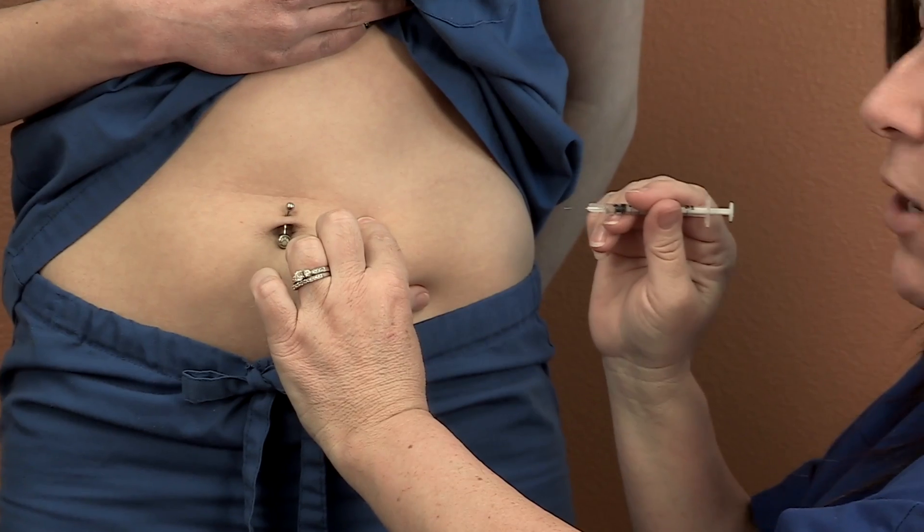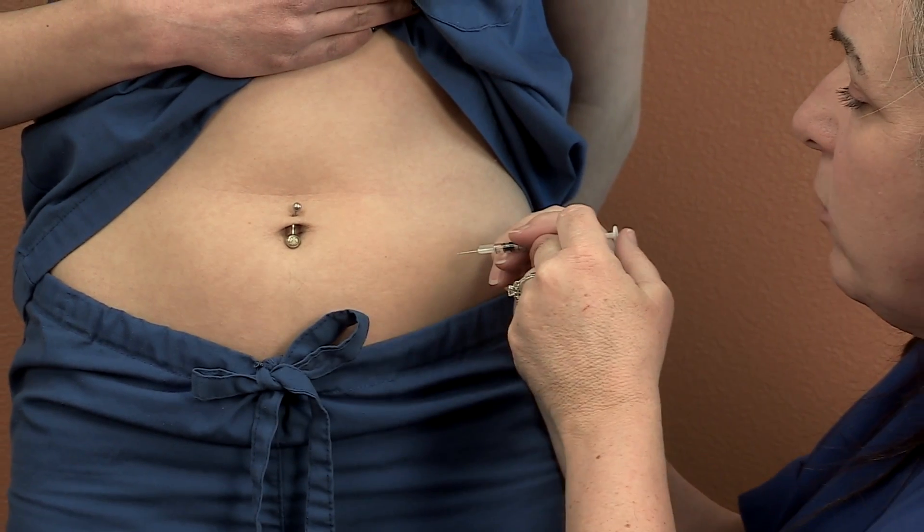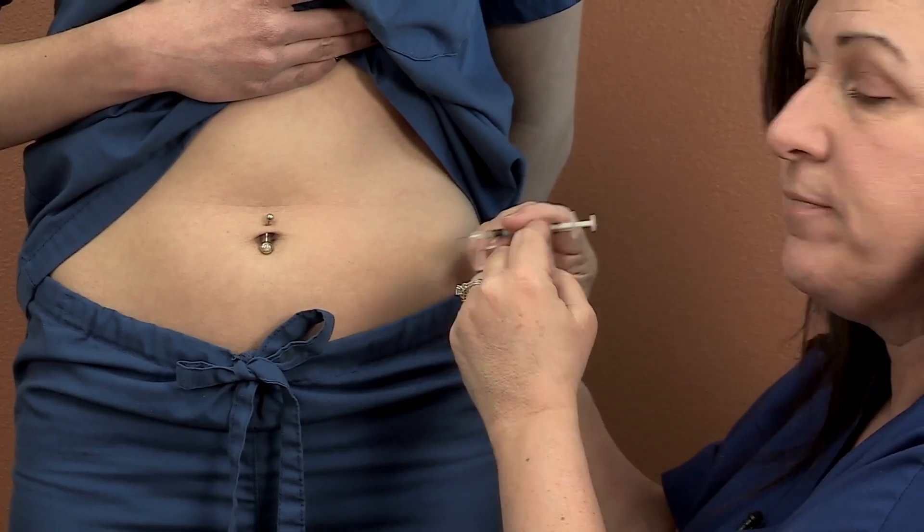I don't take it slow. No fancy angle — just straight in and push that plunger down. That's how you do a subcutaneous injection. Thank you.